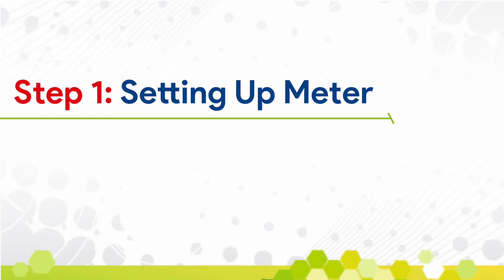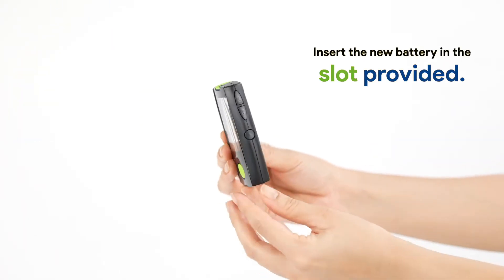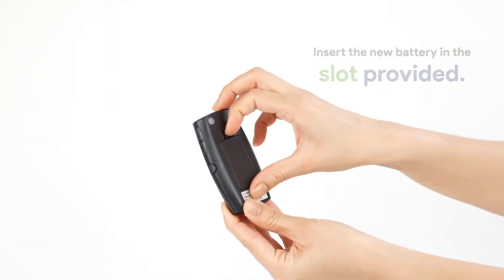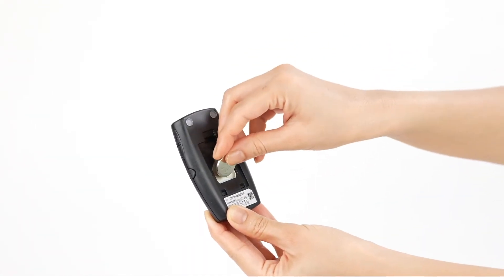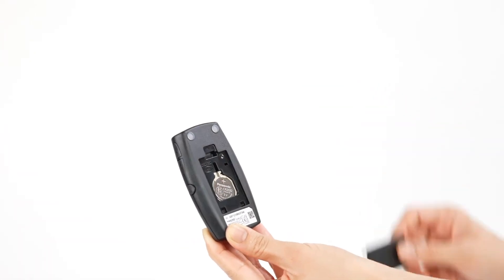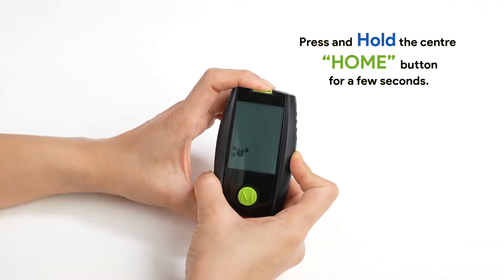Steps for self-monitoring of blood glucose. Setting up the meter: the first step when you buy a new meter is setting it up. Insert the new battery in the slot provided. Then press and hold the center home button for a few seconds. The device will get into setup mode.